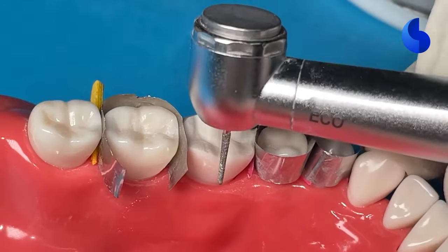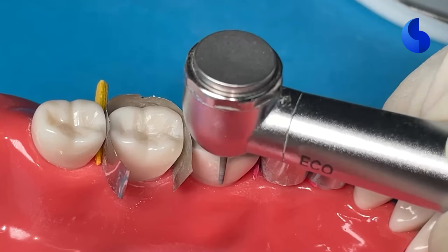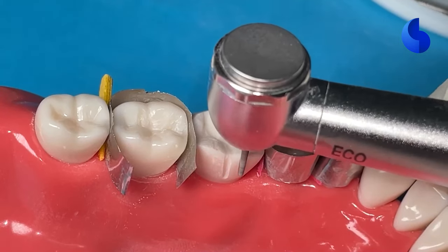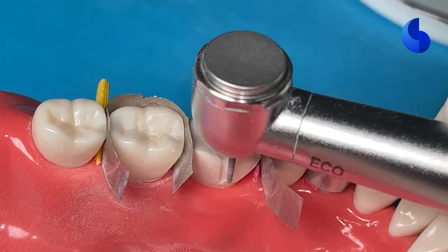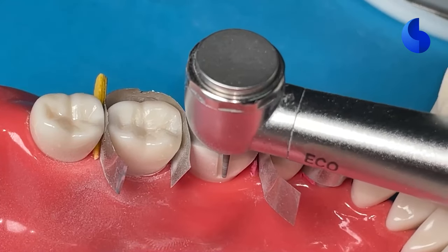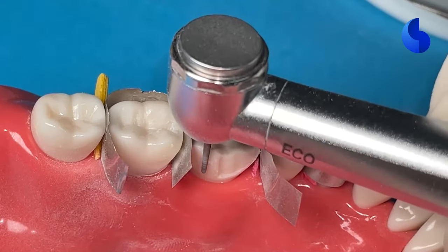Now we'll move on to axial reduction. You can use the same burr, once again, the 856-016 round-ended burr, and start with your depth orientation groove. So if we're looking for a width of the finish line of about 1 millimeter and an axial reduction of 1 to 1.5 millimeters. So once you've placed your depth orientation groove, you can go ahead and start removing the islands of tooth structure between your depth orientation groove.